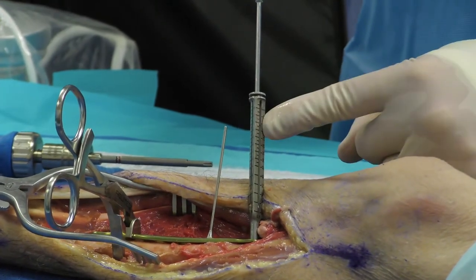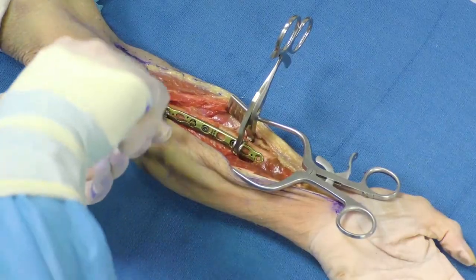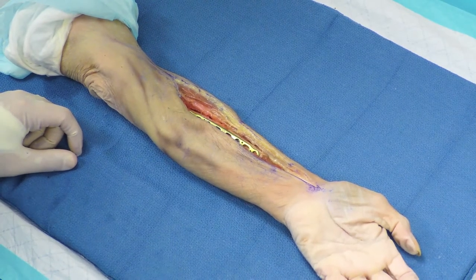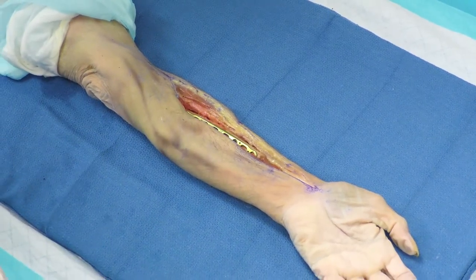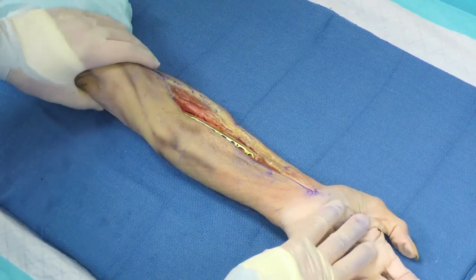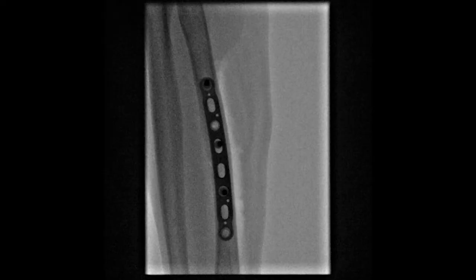The window within the locking tower allows you to read your depth right off the drill bit — in this case we'll do a 14mm locking screw. With three screws in place, appropriate bicortical fixation on both sides of the fracture is achieved. Once fixation is complete, full-length AP and lateral films of the forearm are obtained to confirm the anatomic bow is restored in both planes. On the AP view, the anatomic plate matches the anatomic bow of the radius; on the lateral view, the dorsal bow is also respected and restored by appropriate plate application.